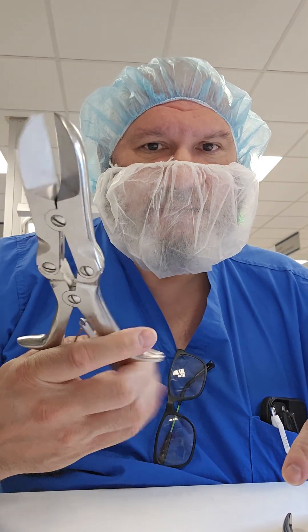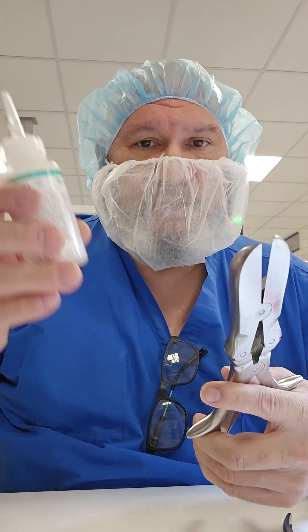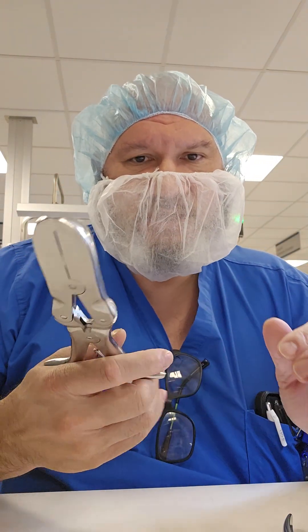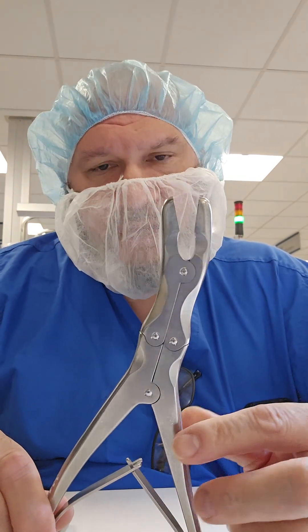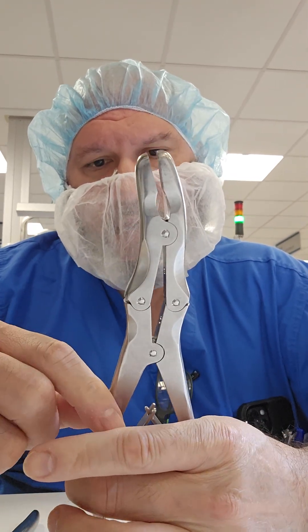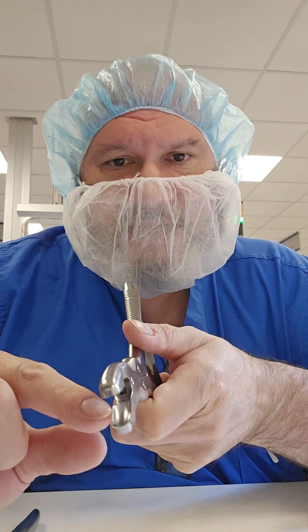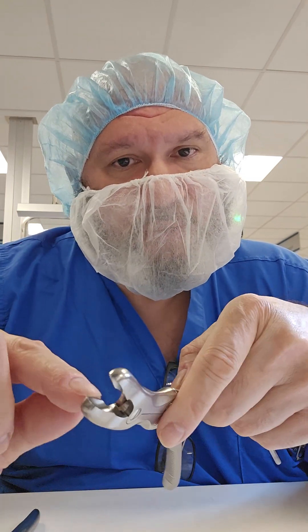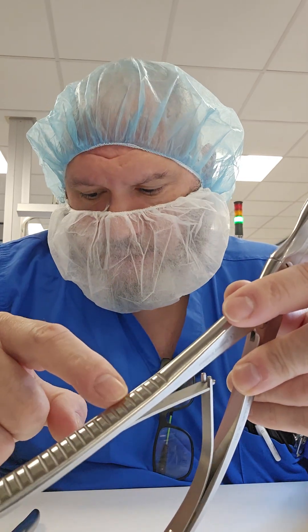It might be a good idea to lubricate at the pivot points — grab some instrument milk and apply it at those loop points to keep the instrument operating smoothly. If it's sticking, use instrument oil or instrument milk and articulate the device. For the Lexel rongeur, inspect in between the joints; it's very common to find a chunk of bone in that little cup, so that's a great inspection point.